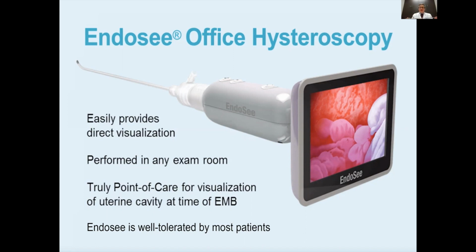The disadvantage, and the reason this is more uncomfortable, is because it requires anesthetic. It requires the cervix typically to be dilated or kind of forced open a little bit, which can be very uncomfortable. And then the insertion of the camera itself, due to its rigid nature, in some patients can provide varying degrees of discomfort as well. So most patients require some level of anesthetic to have this procedure performed.